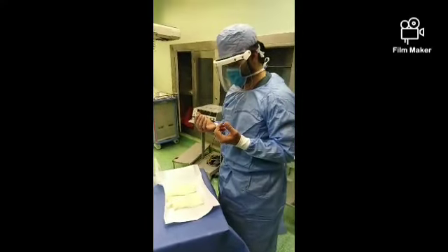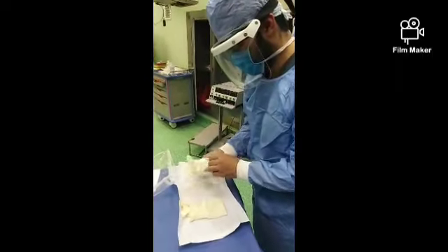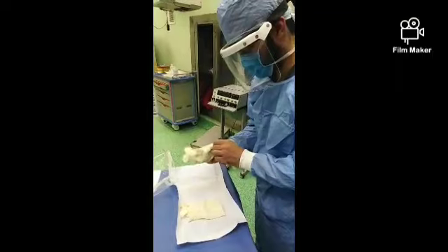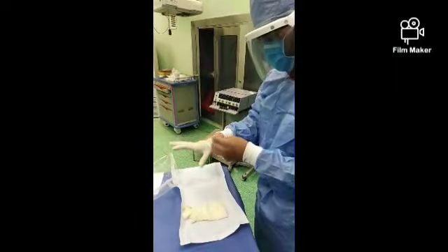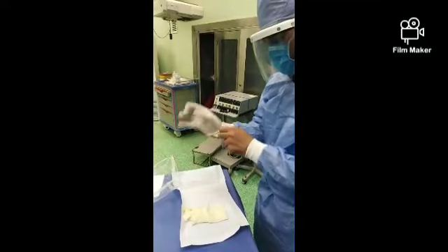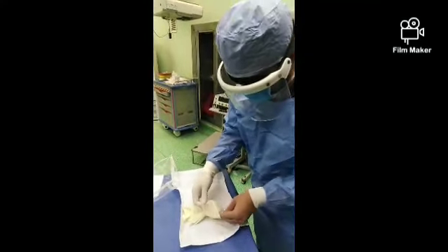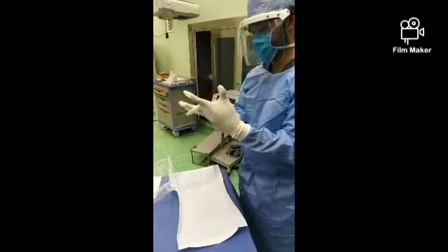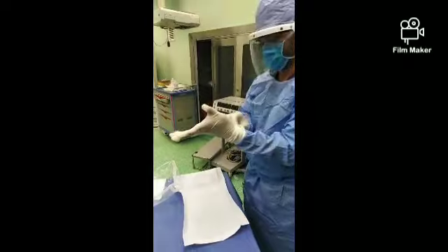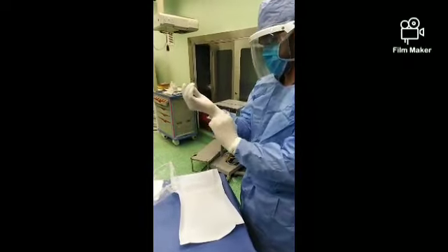Now Dr. Mohamed will show us how to put on sterile gloves with the non-touch technique. He starts with his right hand, only touching the inner surface of the glove. Then he goes to the left side, touching the sterile surface with the gloved right hand, and he puts the left side on too. Now he can readjust the gloves.